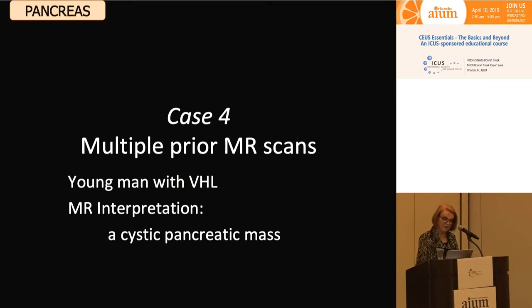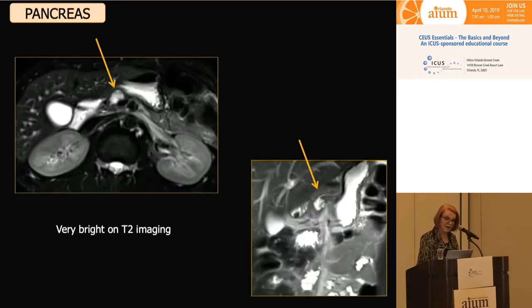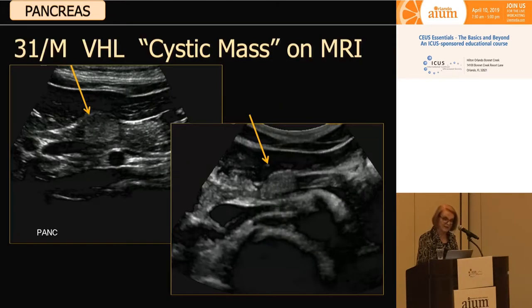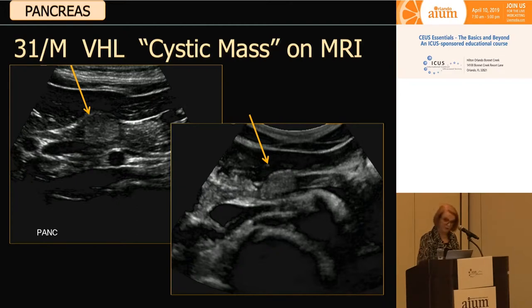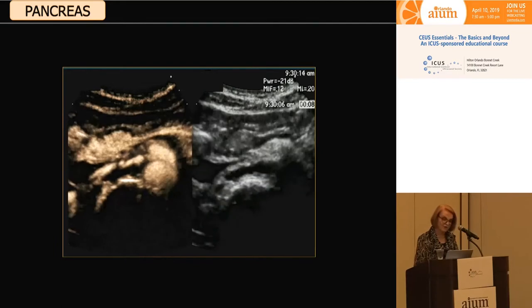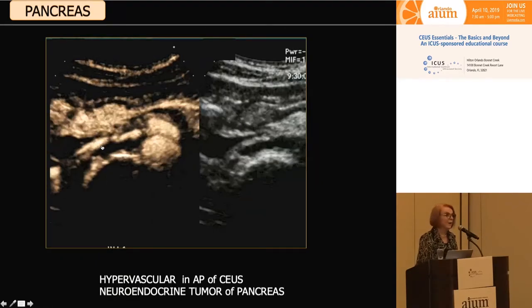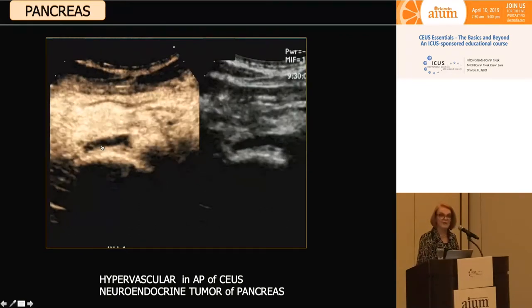Another pancreatic case: a patient with von Hippel-Lindau disease and multiple prior MR scans, which interpreted a cystic pancreatic mass. The MR T2 imaging shows a very bright mass — suggesting cystic or fluid content. Post-gadolinium, there's not a convincing enhancement. However, when the patient comes for ultrasound, we don't see a cystic mass at all. On the long axis and axial view, we see an echogenic, obviously solid-looking mass in the pancreas. On contrast injection, this mass is hyper-enhancing. Not only is the mass not cystic — the mass is not avascular either. This is a hyper-enhancing solid mass lesion.